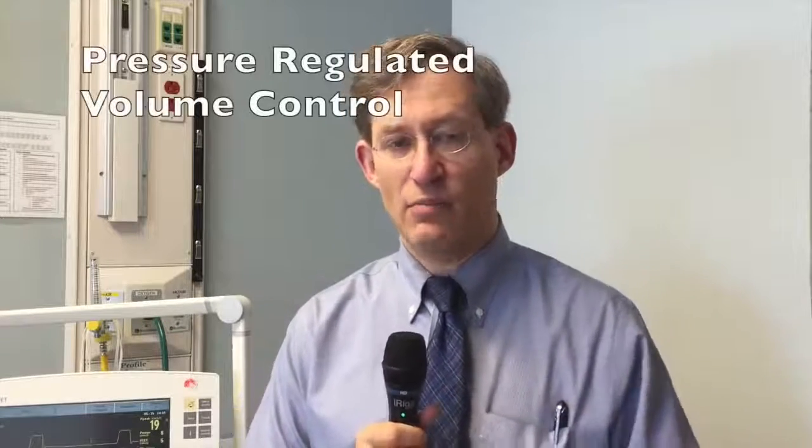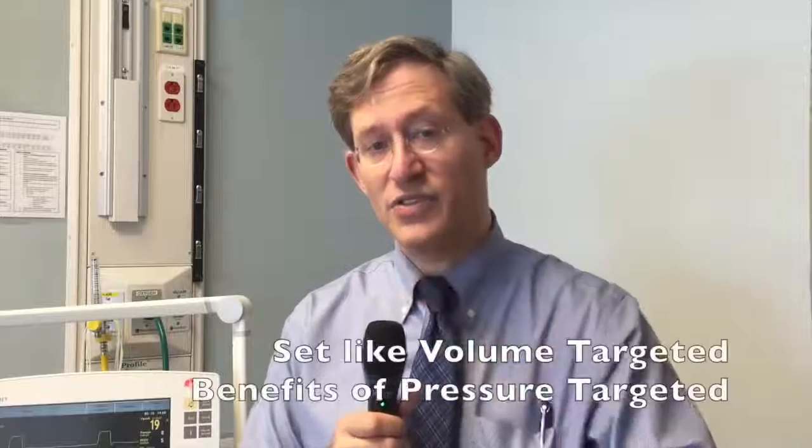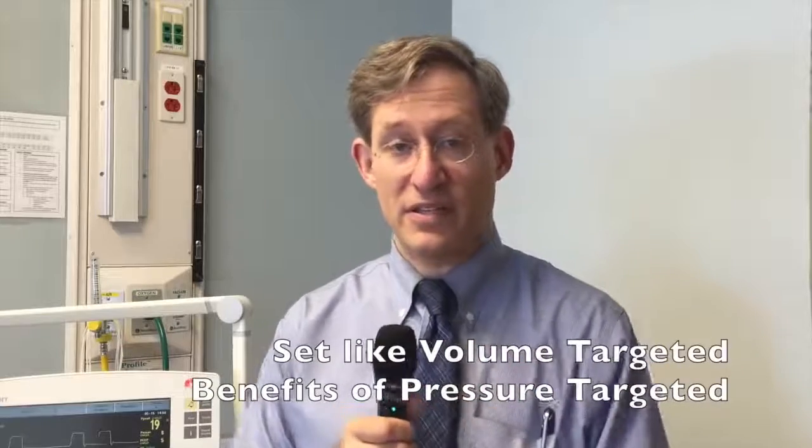In this particular intensive care unit, our most commonly used ventilator mode is what's known as PRVC, pressure regulated volume control. And you can get through the whole rotation and think of it as a form of assist control, but it's actually a complex mode. And it's what's called a dual mode of mechanical ventilation, in which you are setting it as though it is a volume targeted mode, but it's really a pressure targeted mode where the computer in the ventilator is titrating the pressure target up and down to deliver the tidal volume that is set by the clinician.